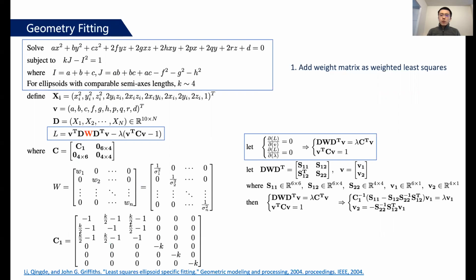Instead of using least square estimation, we used weighted least square ellipsoid estimation in our paper, which is more accurate since the variance of network predictions becomes smaller as the tool approaches closer to the retinal surface. We will show this trend in the results section.